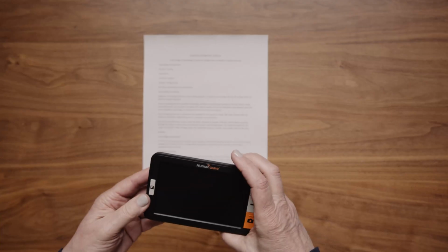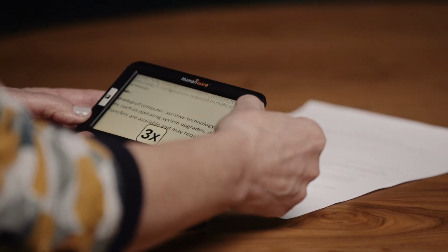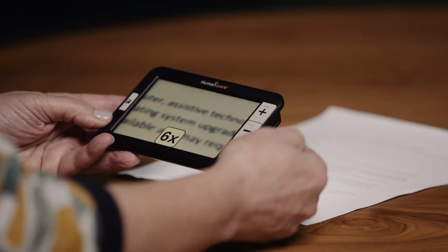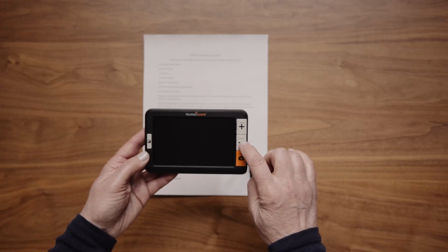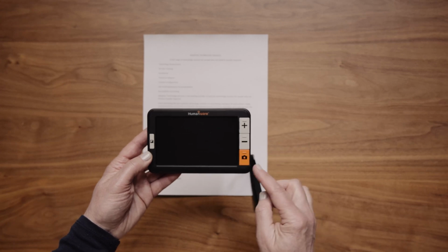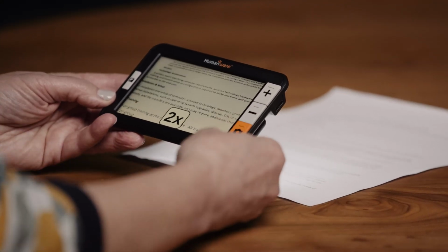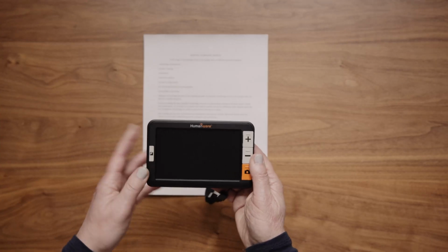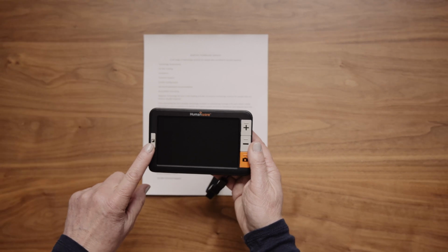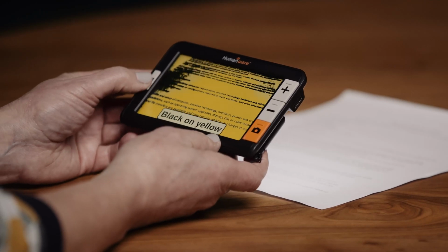Tap or press and hold the Zoom In plus button, top right-hand side, to increase magnification. Tap or press and hold the Zoom Out minus button, middle right-hand side, to decrease magnification. Use the contrast button, left side of the screen, to cycle through contrast color schemes.